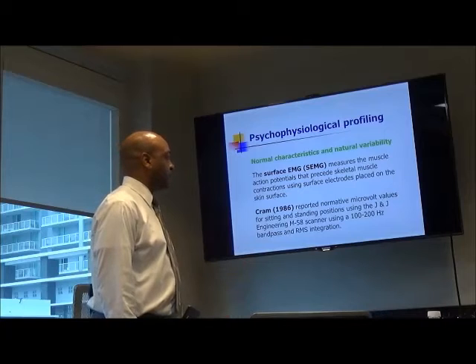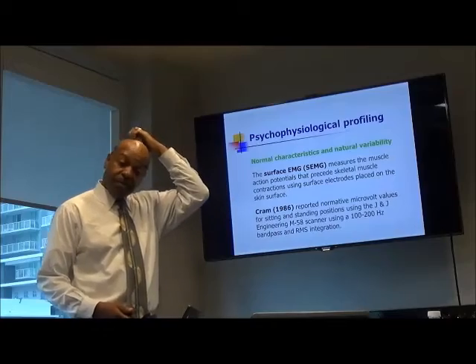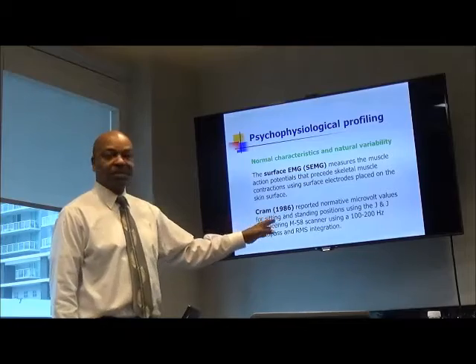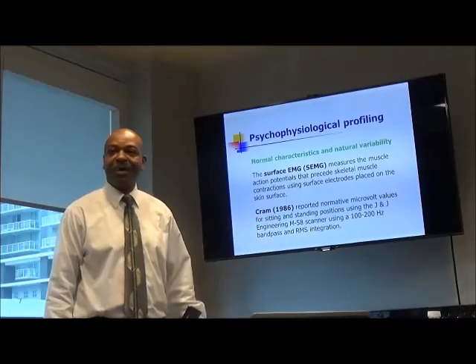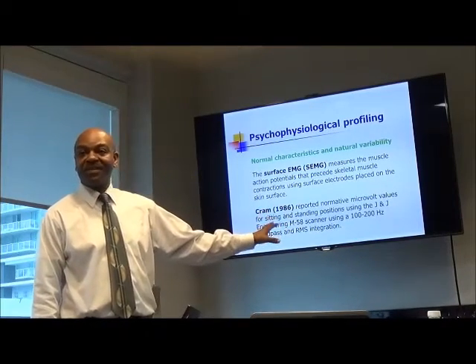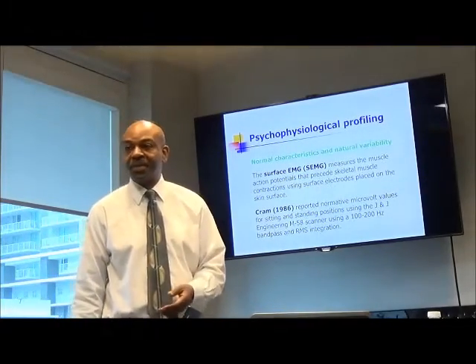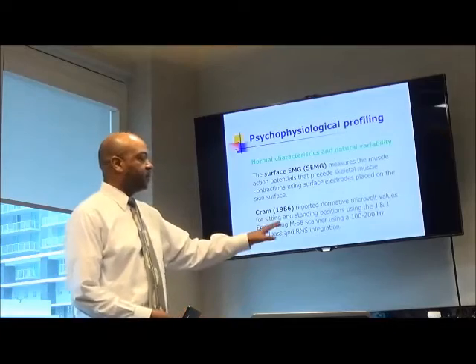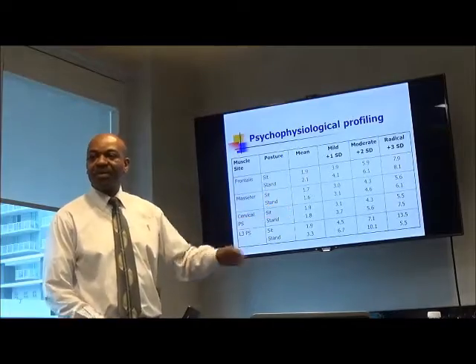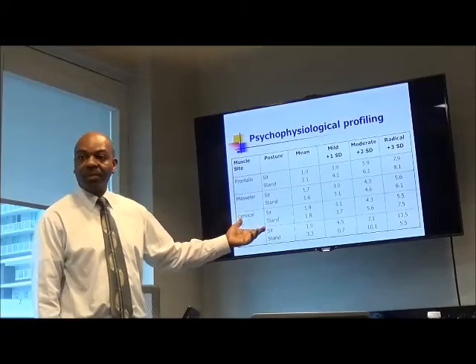Next is surface EMG, and some of the earlier work with... not early work, but this is actually around the time when I started in biofeedback, 1984. Jeff Cram. He did a lot of work in surface EMG, and he came up with a chart of readings that you can use as somewhat of a guide in terms of what would be normal readings.